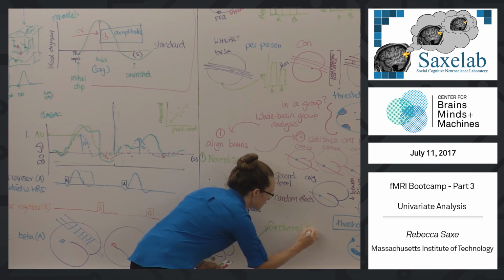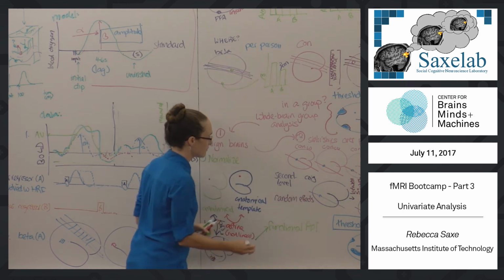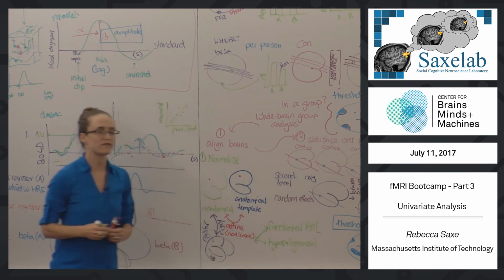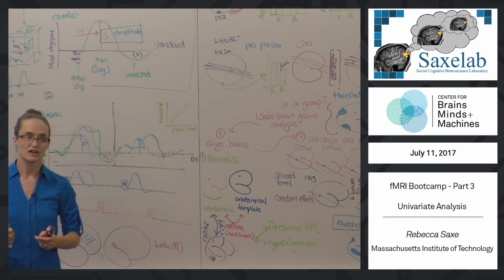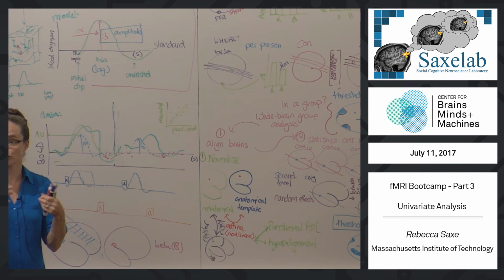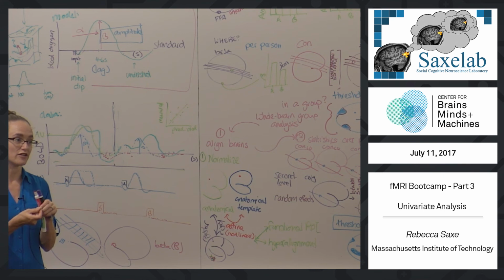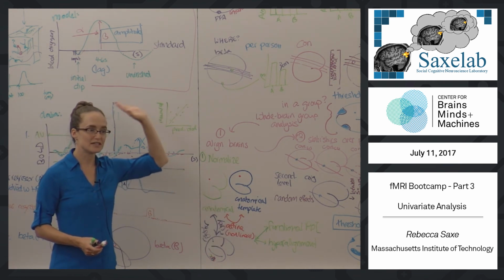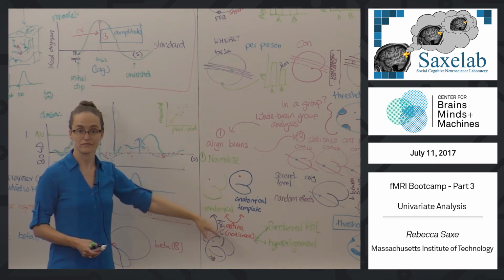One is functional regions of interest, which I talked about a little bit before. The other is hyperalignment. Both of those are tools for once you get your brains pretty close to aligned based on the spatial structure you can see: adding functional information to match voxels to each other, not only that are in the same spatial location, but that also seem to have a similar function in some way or other. Okay? So we can come back to what those are and exactly how they work, but just to give you the sense that that's the problem they're solving.